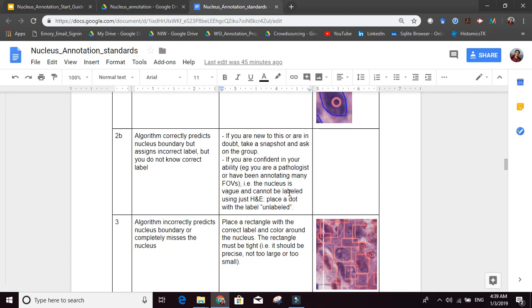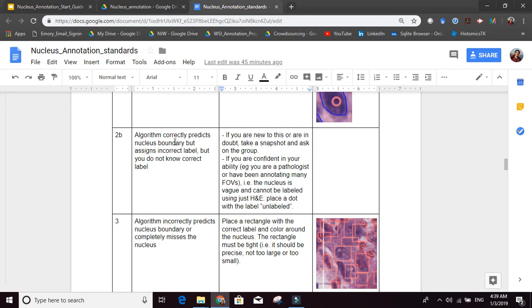Okay, no problem. The algorithm correctly predicts the nucleus boundary, but assigns an incorrect label, and you don't actually know what the correct label is. If you are new to this and you're not sure, then you can take a snapshot, put it in the group, and ask.